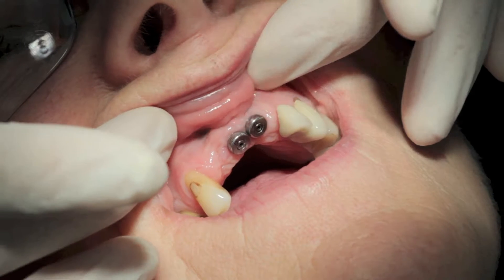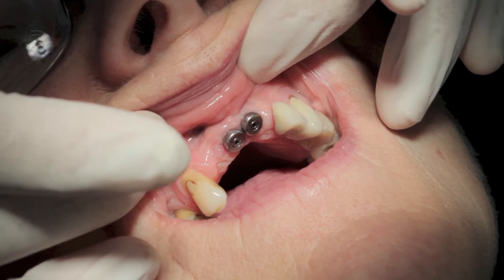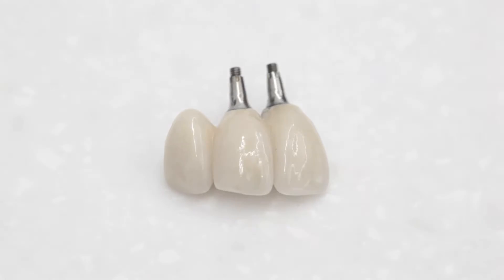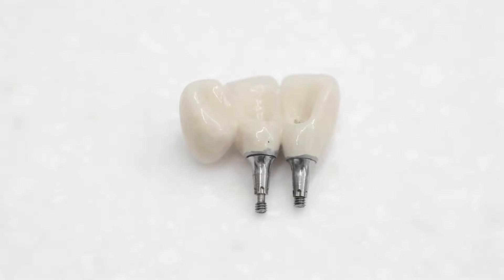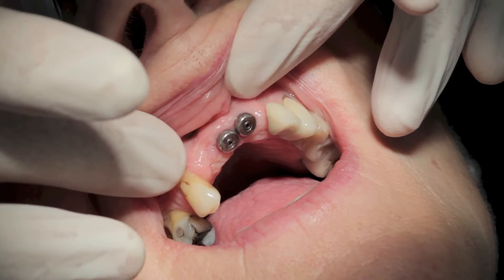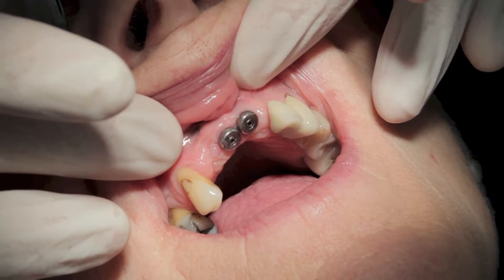Hello, this training video will lead us through the steps required to fit an implant bridge. Today we are trying in and fitting the definitive screw-retained ceramic bridge supported on two central implants, with a distal pontic replacing the upper right lateral incisor.